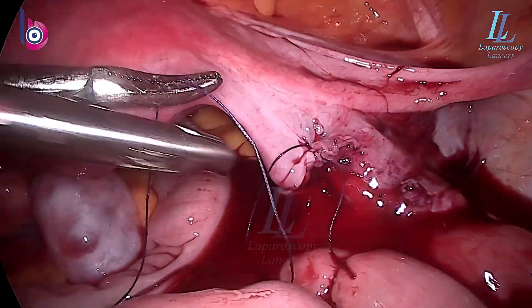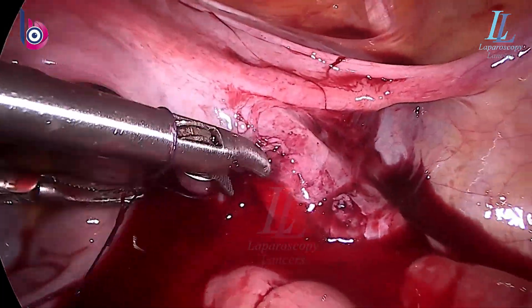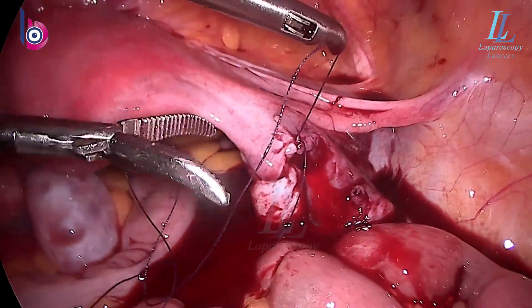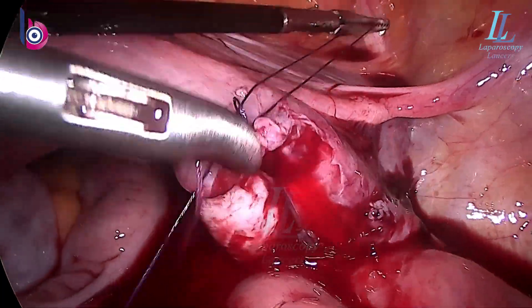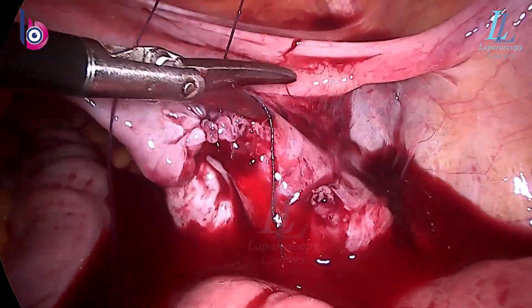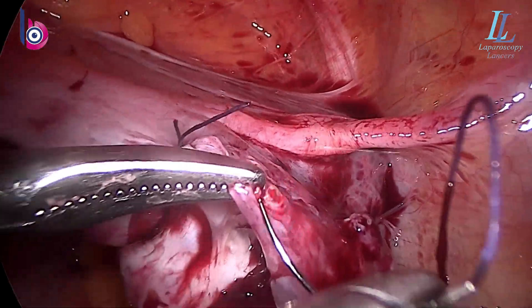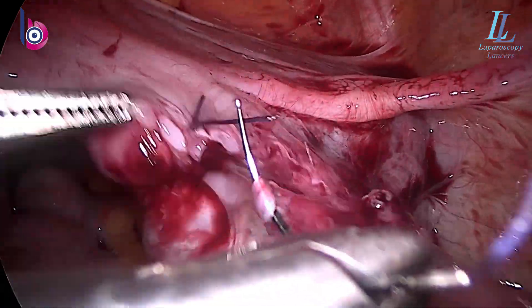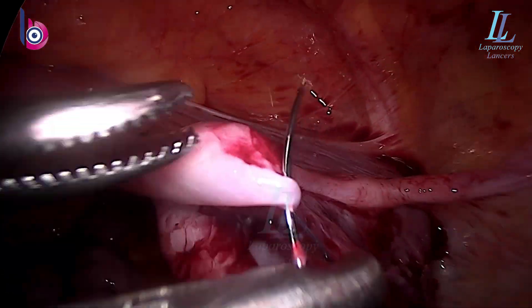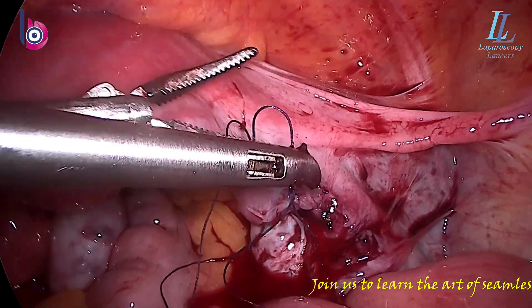Placing the six o'clock suture, then using four-zero Vicryl with regular needle holders and a grasper, the mesosalpinx is tightened to approximate the two ends of the fallopian tubes. They are just at the ampullary-fimbrial junction, abutting the fimbrial ends. I don't know how successful it will be, but we'll approximate both parts. Finally, the anastomosis is in the hands of the body's tissues — or you can say in the hands of God. We'll just approximate it, as the human body is actually very good at rejoining itself.